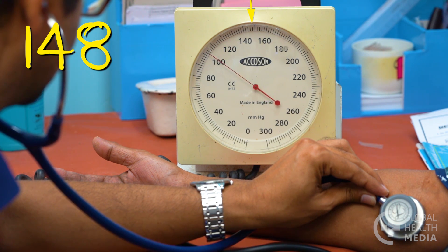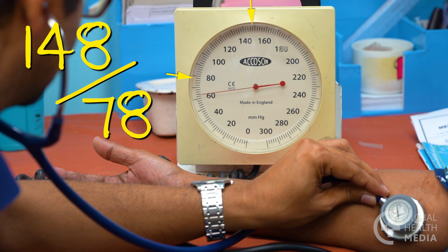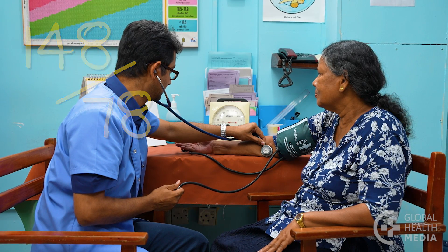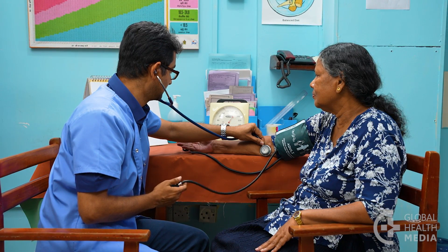The diastolic blood pressure is the number when the sounds disappear. This is the bottom number. Then open the screw valve and let the air completely out.